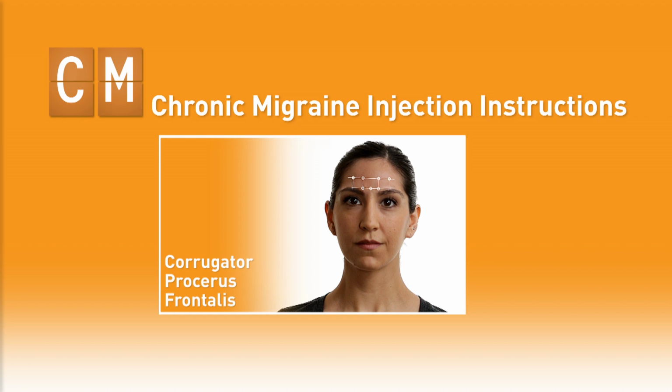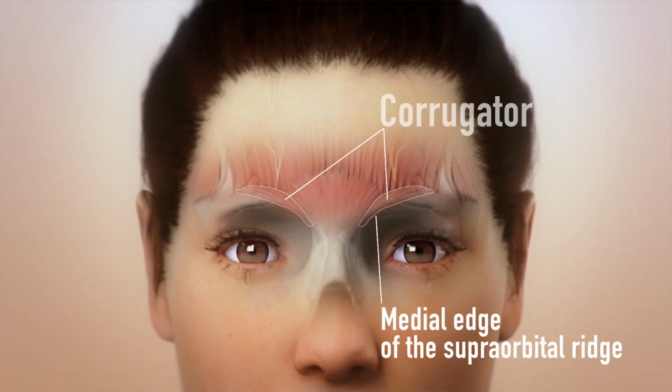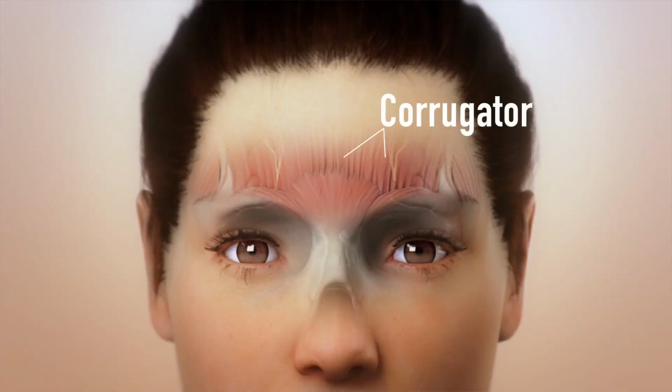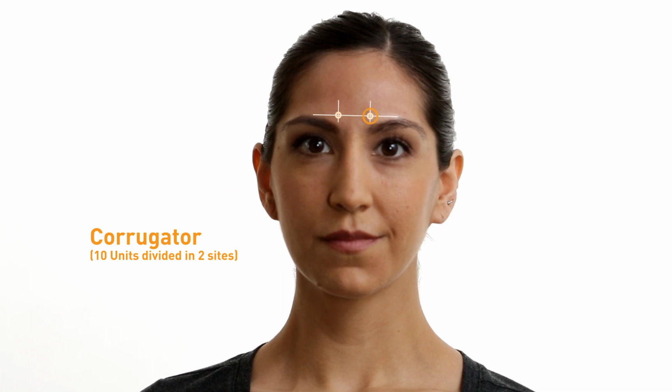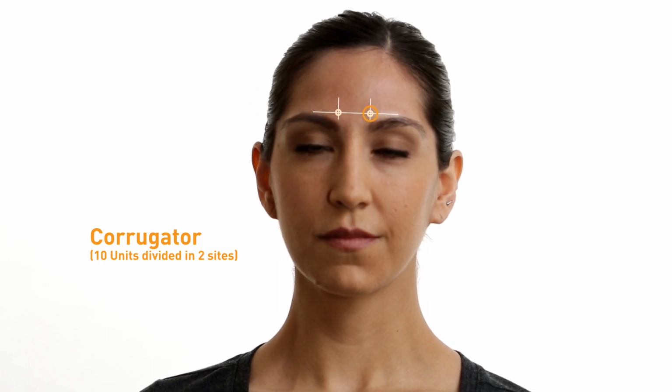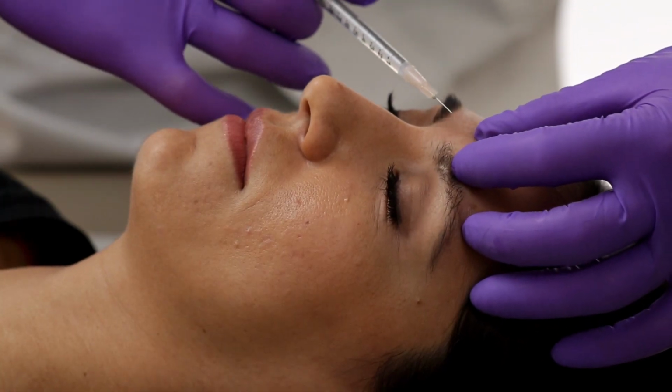Corrugator, procerus, and frontalis. Let's begin with the corrugator, procerus, and frontalis injection sites. The corrugator is located immediately superior and deep to the supraorbital ridge. To locate this injection site, go 1.5 centimeters or approximately 1 finger's breadth above the medial superior edge of the orbital ridge. Pinch the skin at this location.